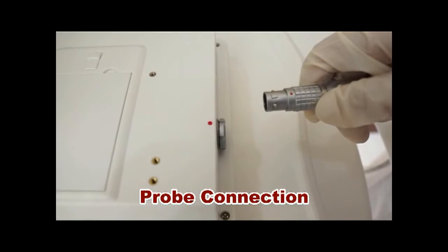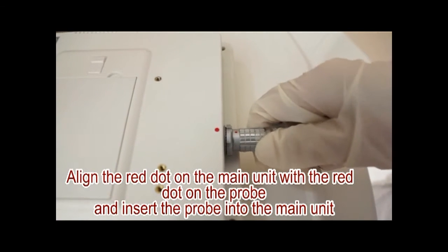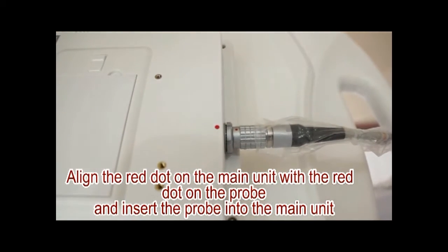Probe Connection. Align the red dot on the main unit with the red dot on the probe and insert the probe into the main unit.